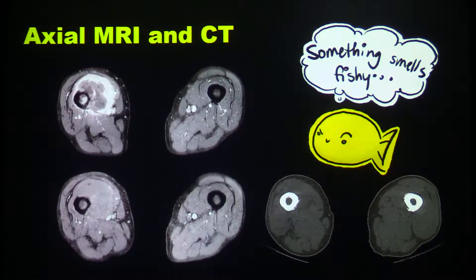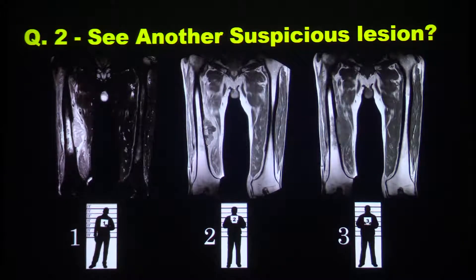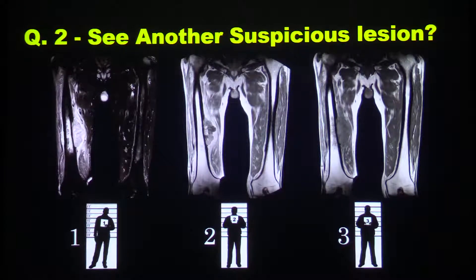He had an MRI scan because there was something a little bit fishy in the study. You can see the MRI scan — we have the T1 with and without contrast and the CT beside it, with an enhancing soft tissue lesion, a lytic component as we saw, and also an intramedullary component. The most important question is: do you see anything suspicious in the MRI? We have three coronal scans — the STIR and the T1 with and without contrast — but there's something else fishy here, something not within the lesion that might direct us toward the diagnosis.